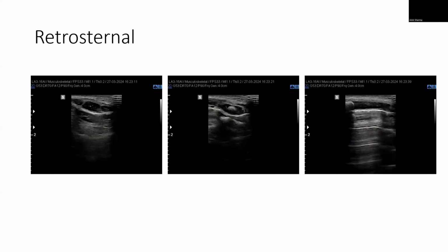I'm just giving you an example of a baby we had when I was in Southampton about 10 years back, who had developed problems with anterior mediastinal air, which was causing compression of the heart. The only way that we eventually made the diagnosis was by doing a CT.